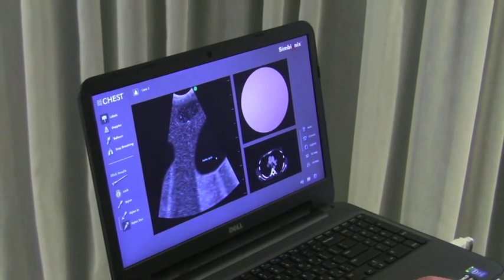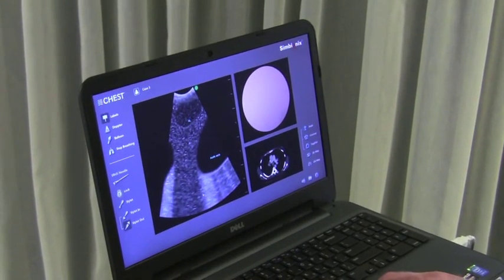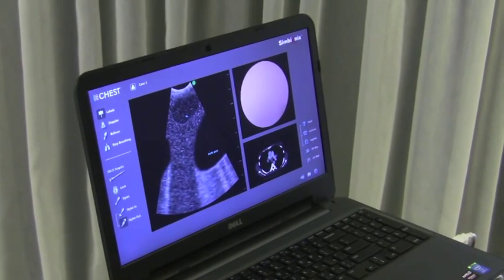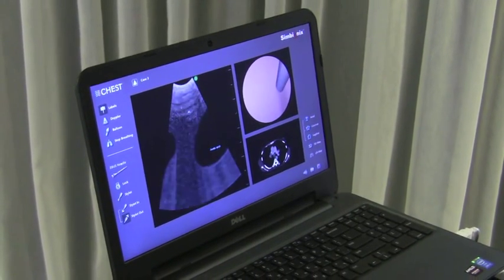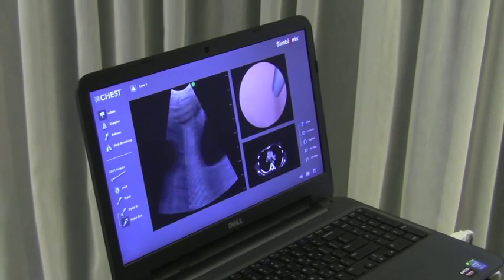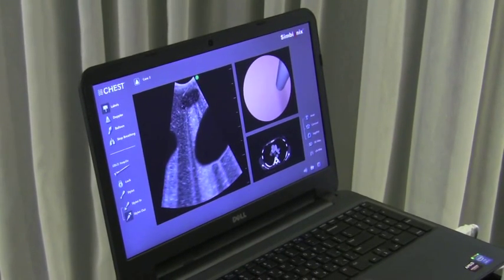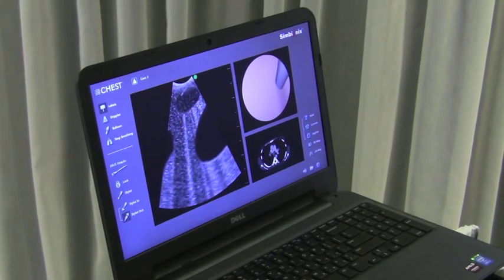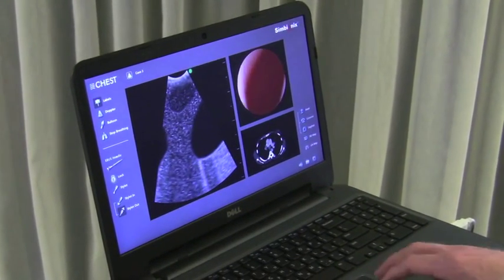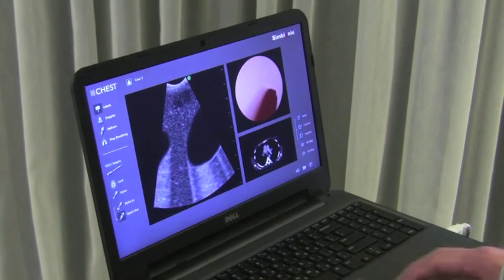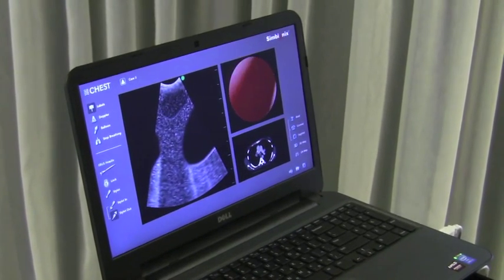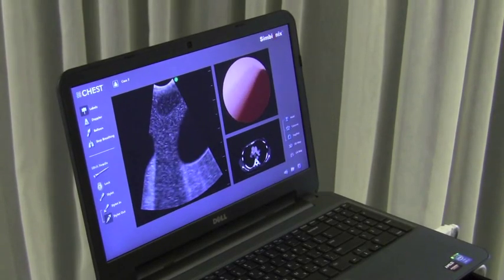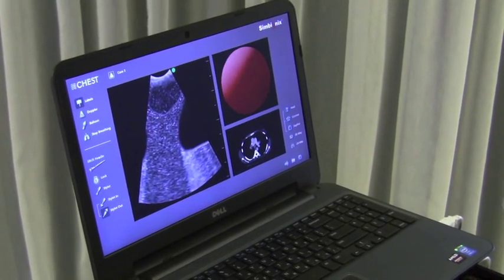They can also sample this with a needle. Here we have the simulation of the needle going into the lymph node. This allows the individual learner to use the simulator to develop a skill for endobronchial ultrasound without patients bearing the burden of that procedure-related training.